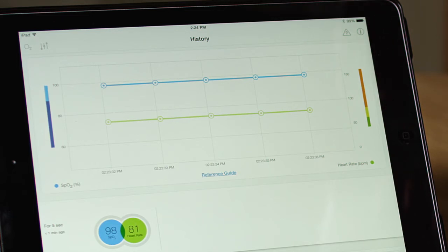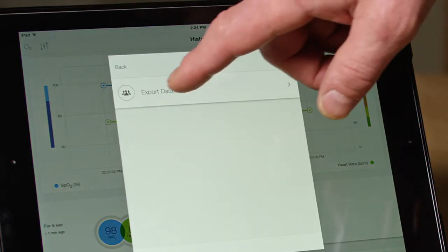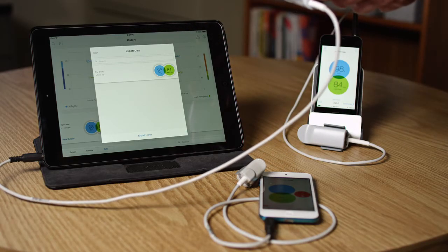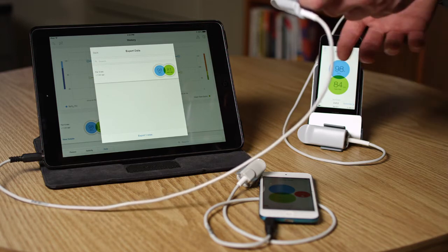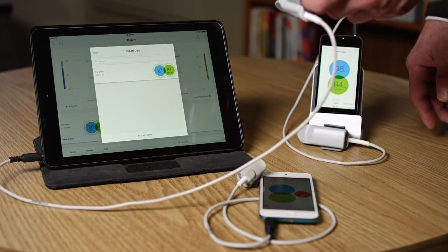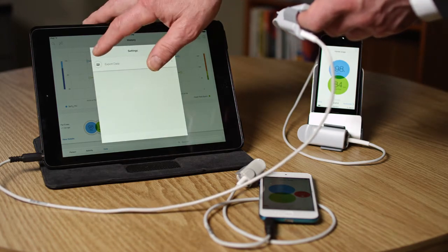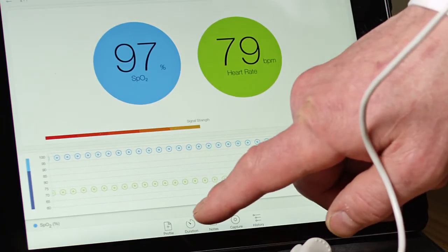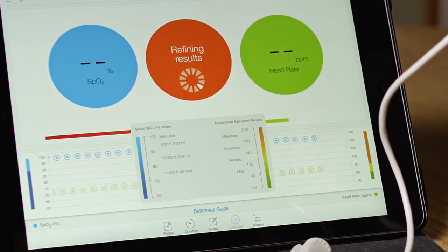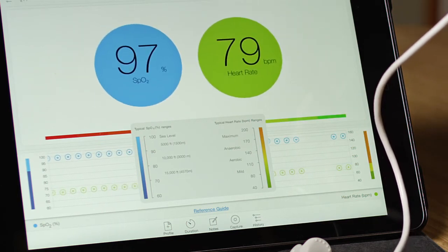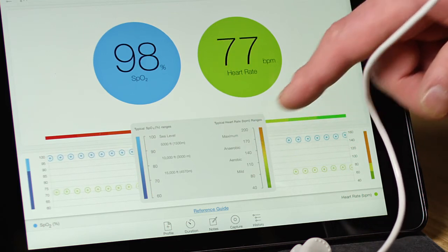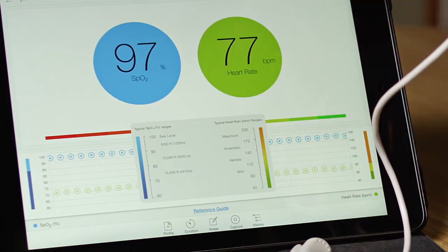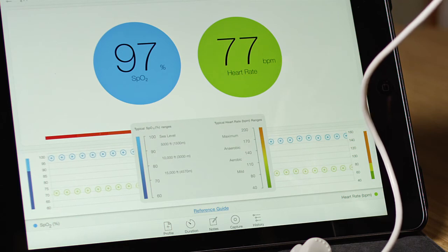I can also export this data, which allows me then to process that data separately on a PC or some other computer. There's a handy reference that gives an indication of the SpO2 values with respect to certain standards, such as typical heart rates or SpO2 values as they would normally be seen at different altitudes.